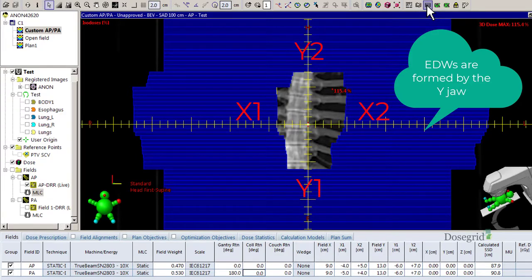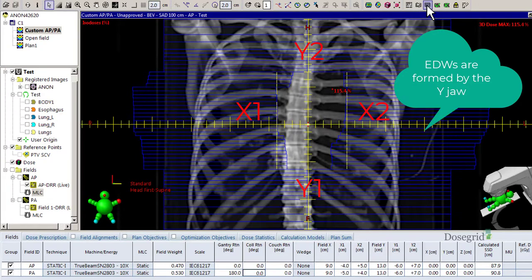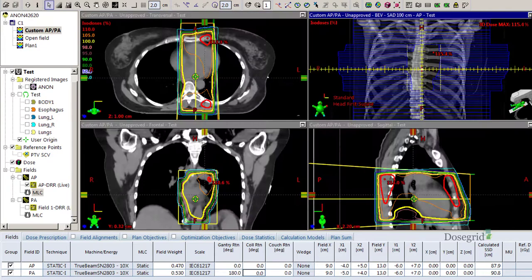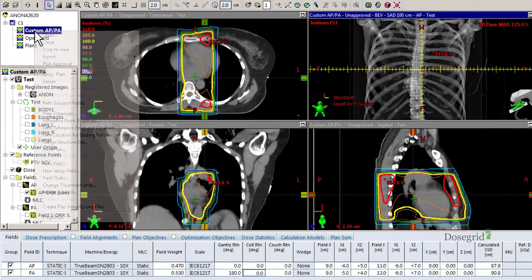Luckily, you can copy your MLCs to a block, change the rotation, and restore custom MLCs at the proper collimator angle.